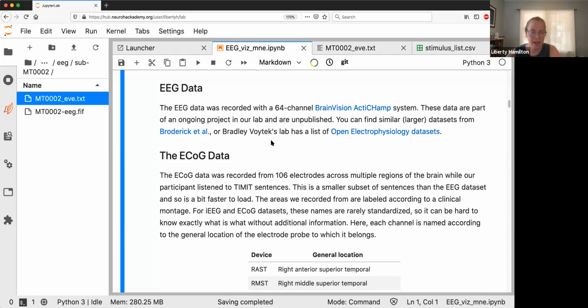robust. And instead of presenting with standard software, we have written custom software in our lab with Swift on an iPad. That is non-standard, but the reason we do that is that we have been collecting data with the same iPad setup for both the EEG and the ECoG participants, so we need something portable like that, and the iPad works well for that. You can also write scripts that will refresh according to the repetition rate of the screen, so you can keep the timing very precise as well.